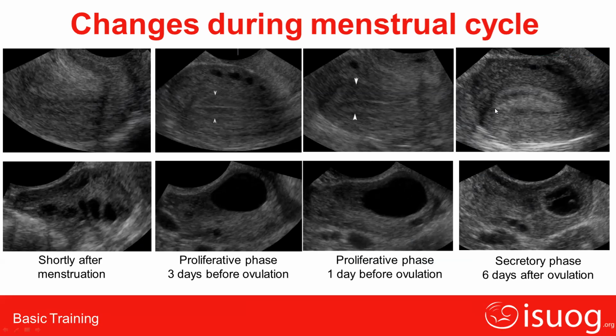Yes, it's an excellent presentation. Posterior enhancement should have been explained in the first session itself. Posterior enhancement occurs when sound waves pass through a fluid medium.